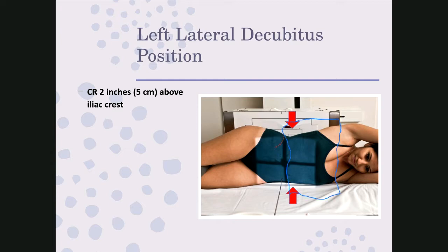And then you would place your fingers in the bottom of the light field, one or two fingers in the bottom, and you would take a second IR so that you overlapped. Okay, so everywhere in here would be overlap on the patient.